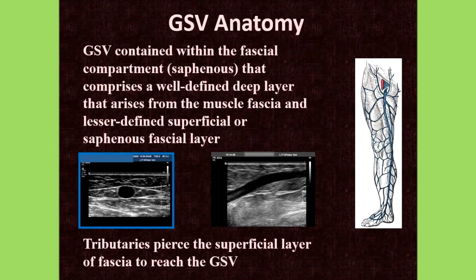That's a great saphenous vein that is actually leaving. You can see it piercing through the fascia and forming a superficial vein that can no longer be called the great saphenous vein. That is not to say that you can't treat that vein if it's a major source for the reflux, but once it exits the fascia, that saphenous compartment, it's no longer the great saphenous vein.